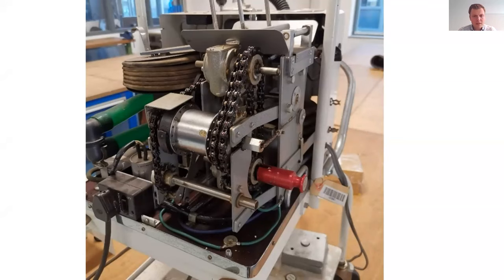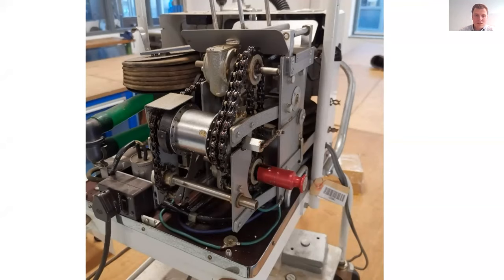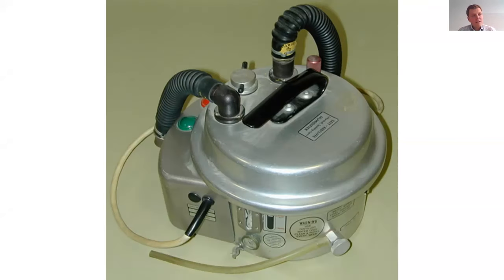When you open the ventilator, there are some parts that you do not expect in a medical device. For example, here you see a gear hub, which was used for the transmission to let the ventilator run at different speeds. I was surprised by that, and at first it did not make much sense. But later on I thought, it is a smart solution because these things are very reliable and abundantly available. There's also the humidifier, the artificial nose, and if you look carefully, you can recognize that it is made out of a household pressure cooker.